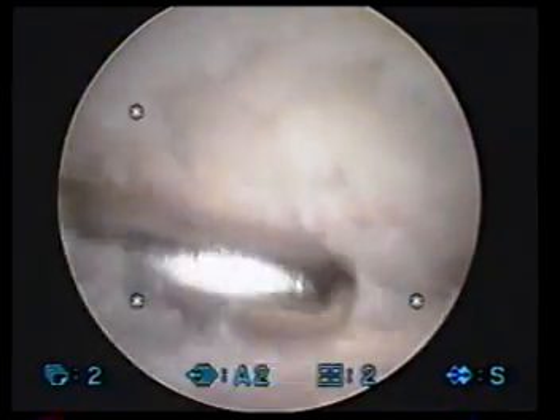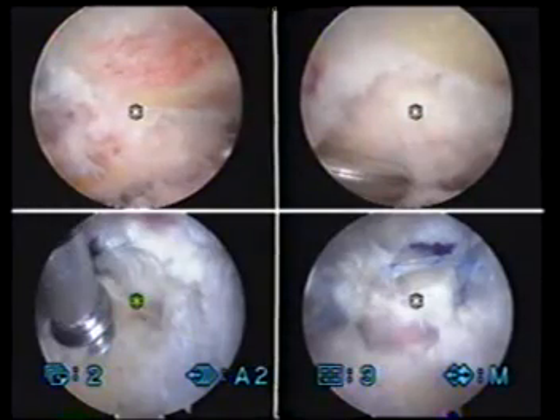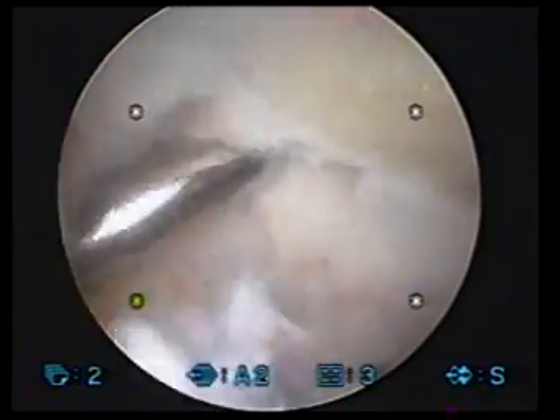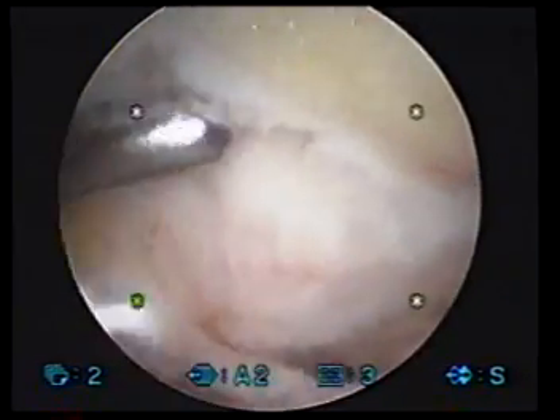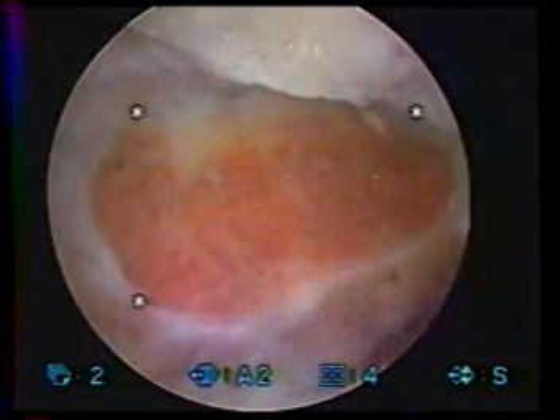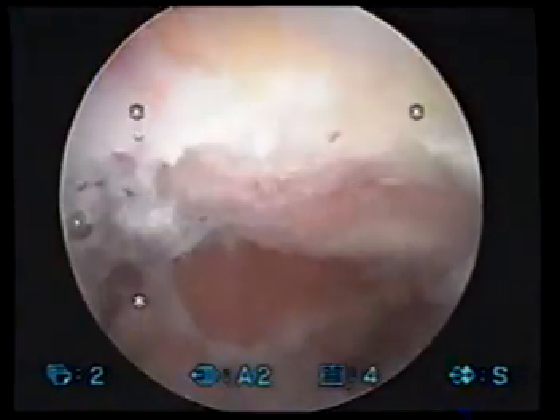And there you see some wear changes right there on the end of that collarbone joint. That's what we're going to be cleaning up for you. We'll use this little shaving device to clean out the joint, and then we'll use our burring device to create some more room there and get rid of the bone spurs. There's the end of the collarbone joint once we've got that all cleaned out. There again is the undersurface of the acromion.